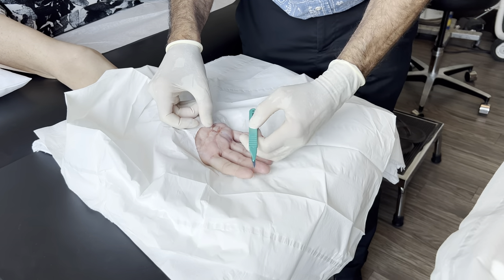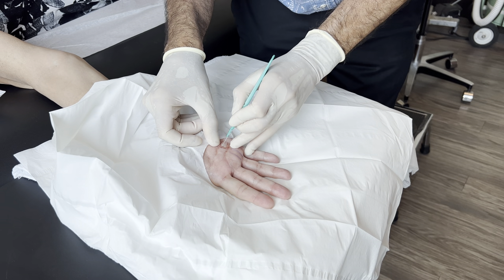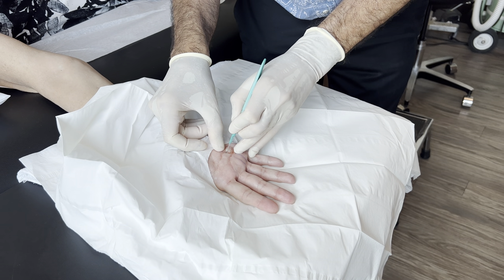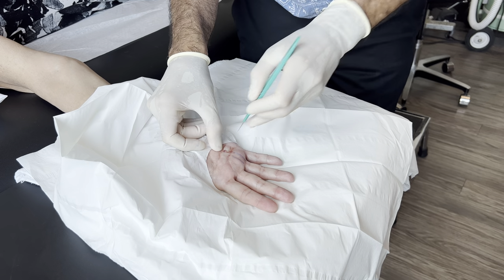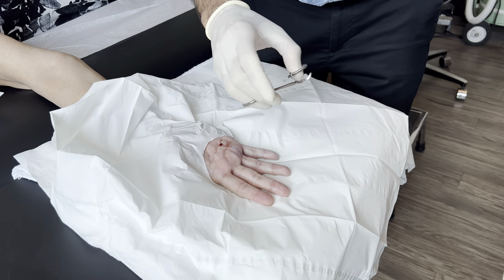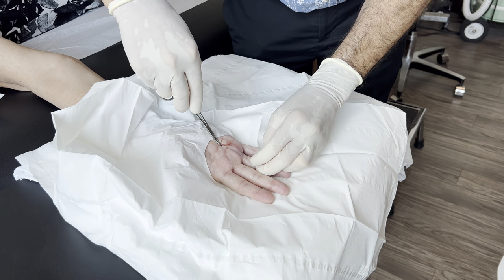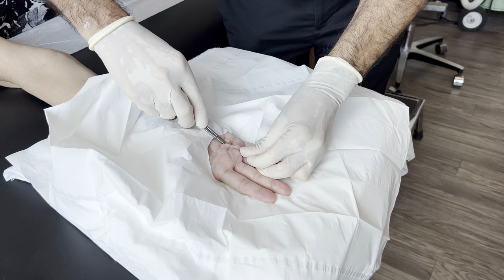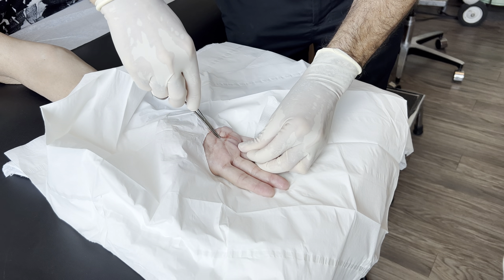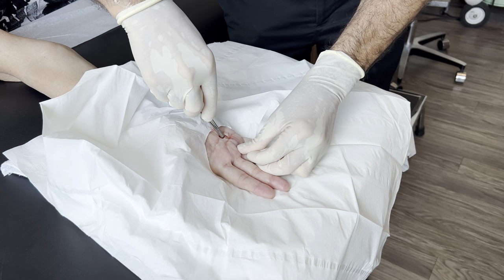So now keep your finger straight. I can't believe it's getting fixed. Making a small incision. How are we doing? Okay. I've had this for so long. We're going to take a little hemostat and just feel the tendon sheath.